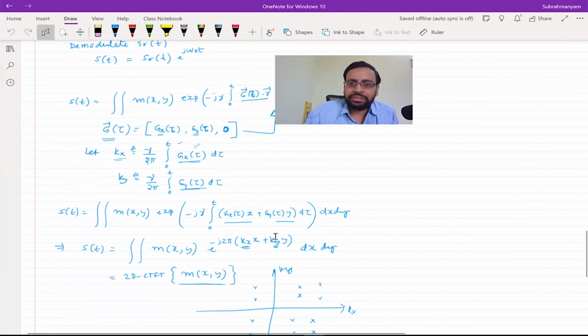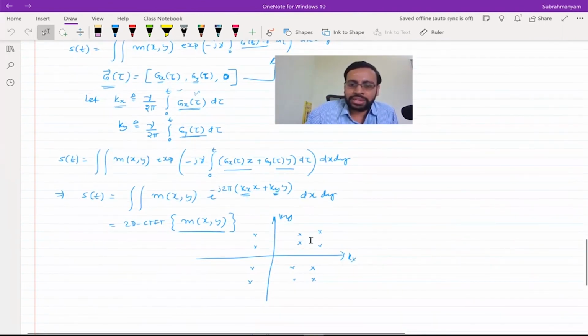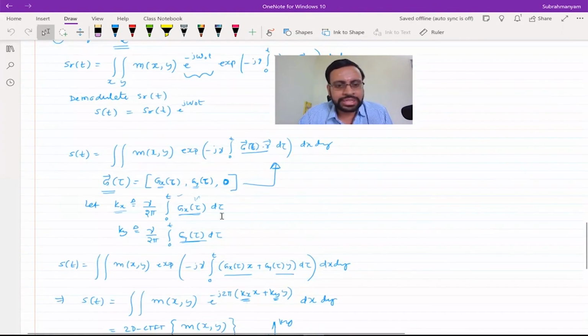And what I have not yet discussed is how you vary, and in order to take samples, what are the different strategies that you could use? This is all pulse sequence generation: in what way would you do it, and how you take the samples of it. This part I have not discussed, but I'm sure you could figure it out from here, and that is pretty straightforward. Okay, how is that straightforward? You could see the relations here.